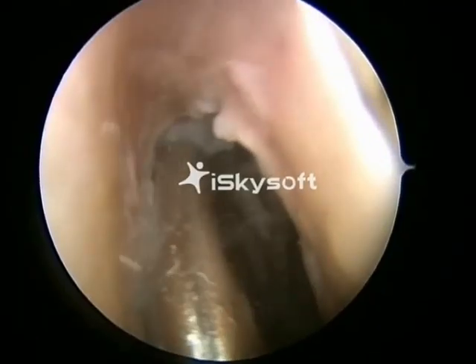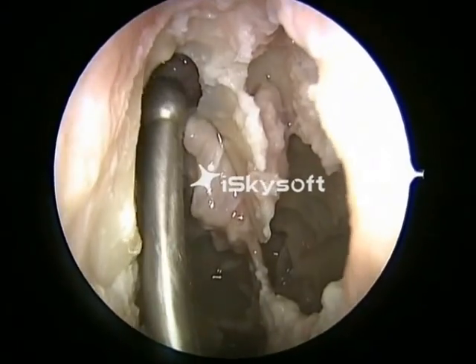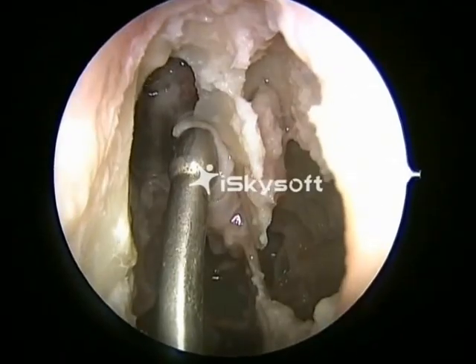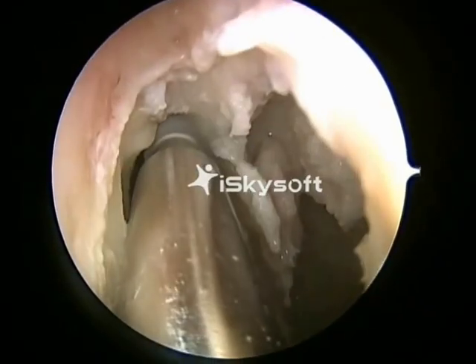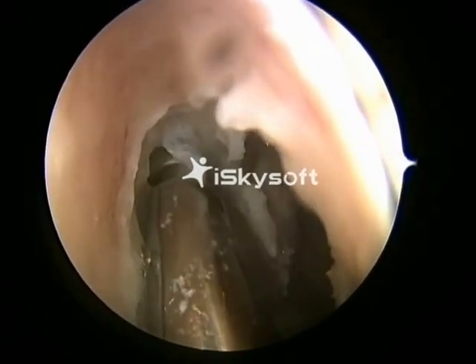Once we have ascertained the posterior limit of dissection, we'll have to curve towards the other side. The whole dissection is done using a 0-degree telescope and a straight burr.